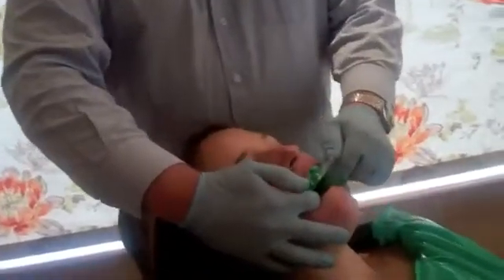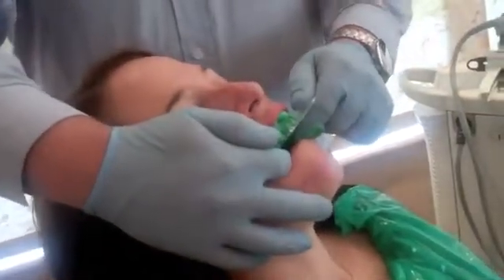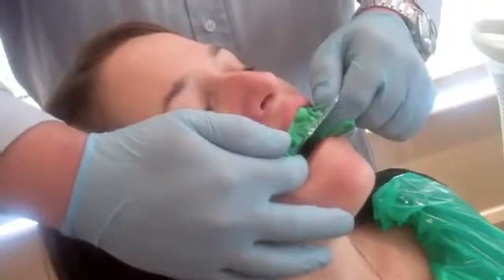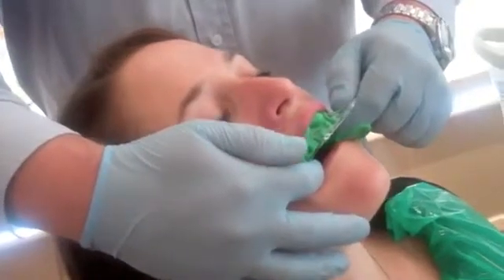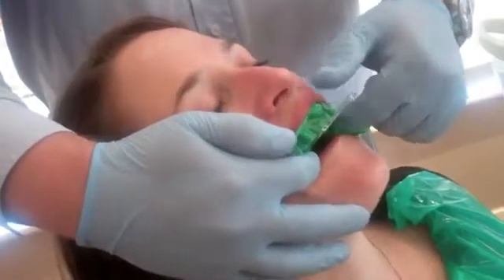In certain patients, this promotes a substantial gag reflex. Once the impression has started, you cannot take it out. So if the patient is to struggle with this process, then it can be quite claustrophobic and certainly quite disconcerting for the individual involved. Obviously, Jen is used to these techniques and, as such, is coping admirably with the treatment.